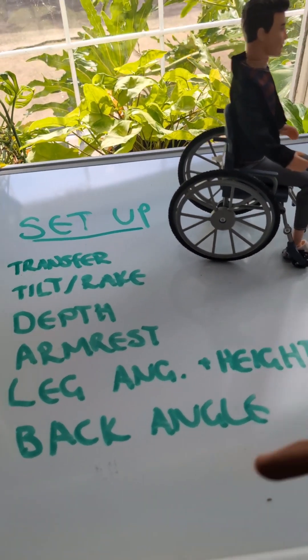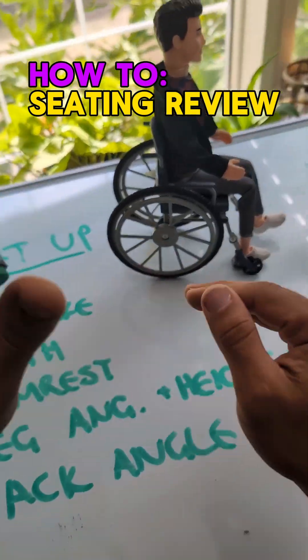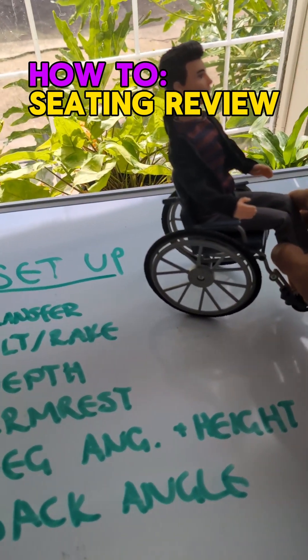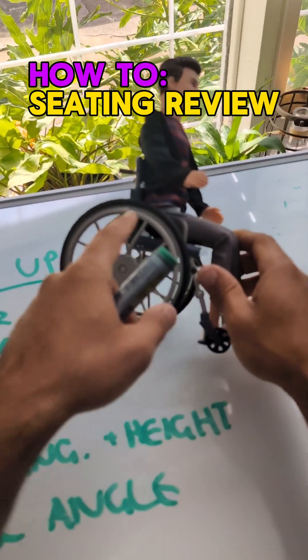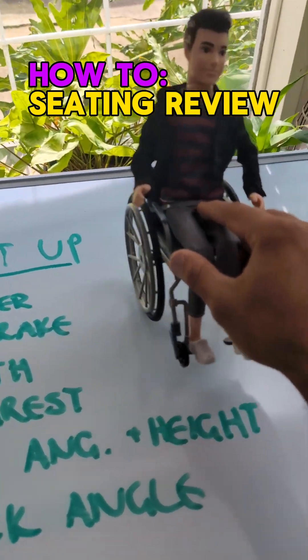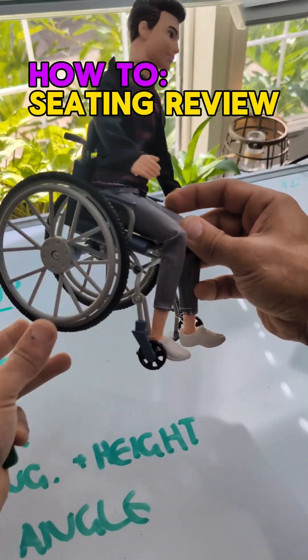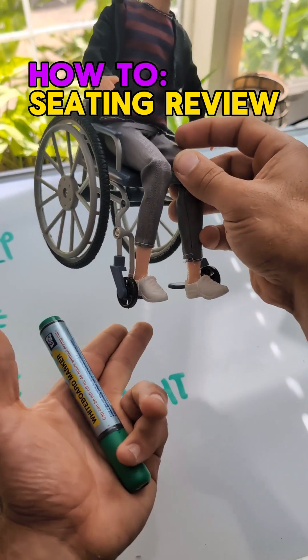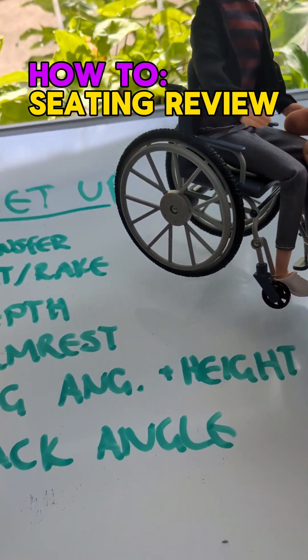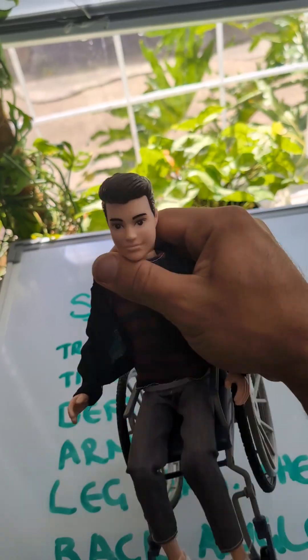In summary, if someone is in a posterior pelvic tilt, check the setup. First, make sure they are transferred properly — lean them forward, scoot them back, and get the hips all the way back. Then make sure they're in some level of tilt or that there's a rake in the chair. Check that the seat depth isn't too long. Check that the armrests are at the right height. Check the legrest angle for hamstring tension — if you lift the leg and there's barely any more movement, the legrest angle is probably too far out. Make sure the foot plates are touching the feet without lifting the knees or letting the feet drop. Finally, play with the backrest angle for comfort. Stay tuned for part two.